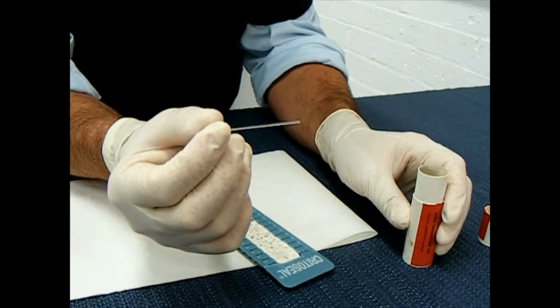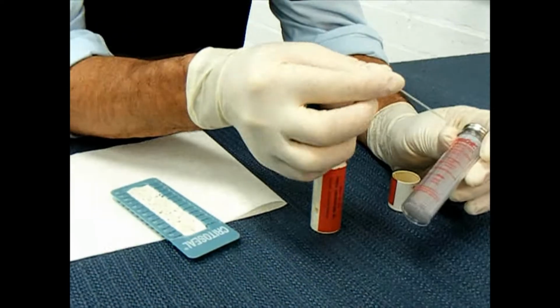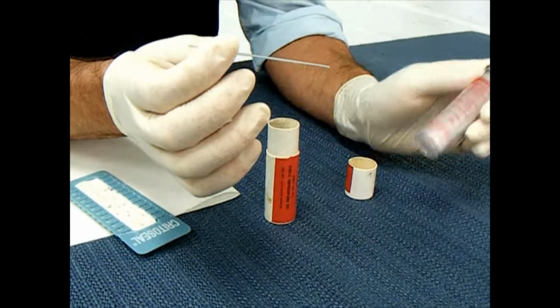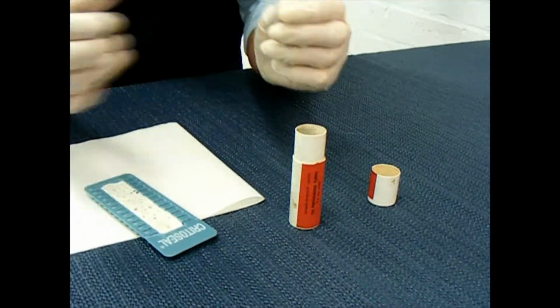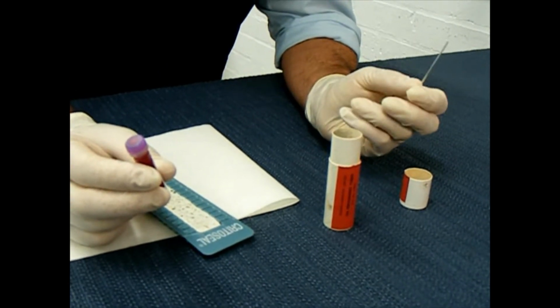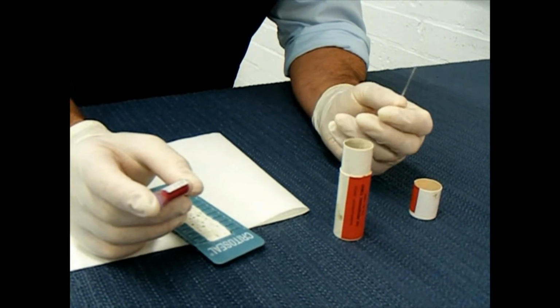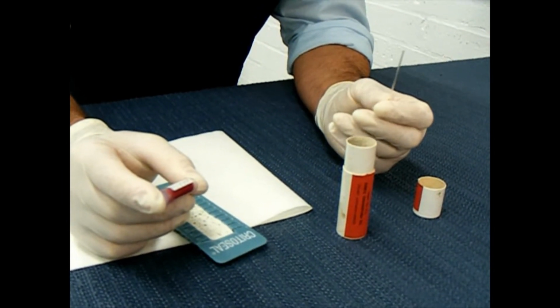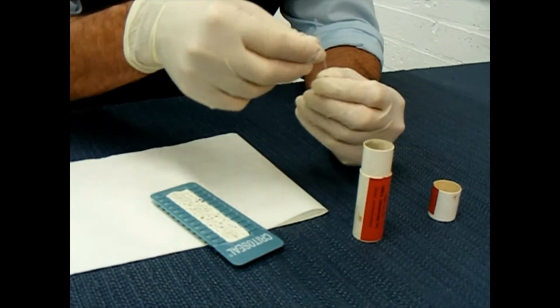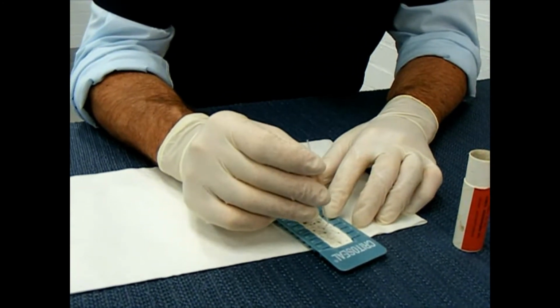Some of them are plain, some of them come clear like that. These ones are what's called heparinized, so they've got a bit of heparin on the inside of them. If you're using a blood sample which is in an EDTA tube, it doesn't matter if your capillary tube is plain or heparinized. The only time that you need a heparinized tube is if you're collecting the blood straight from the patient, that we don't do. So with the capillary tubes, after we've sucked the blood up, we plug it into the plasticine.